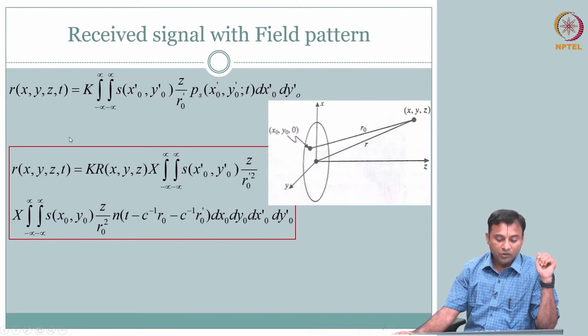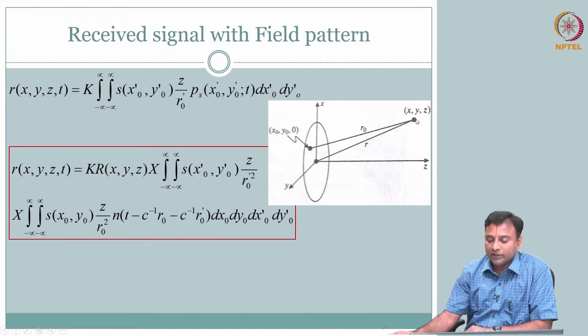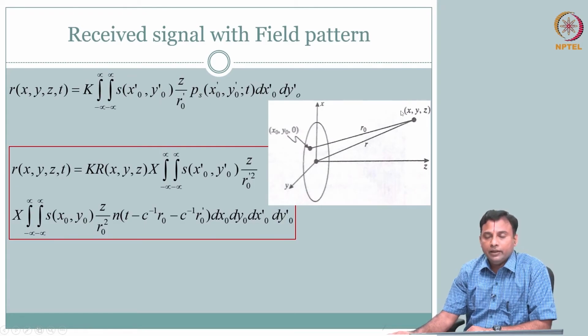So, what do I do? I have a collection of points. You could just use the simple superposition theorem, each point is contributing, maybe they are distributed differently. A collection of that is what you are going to see.